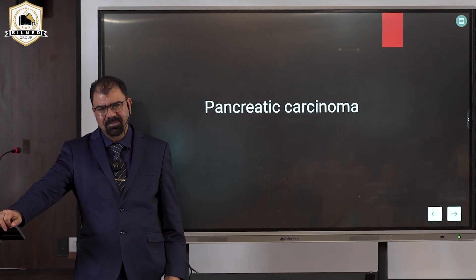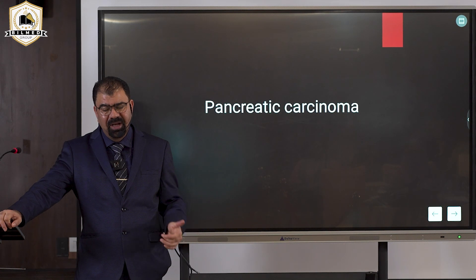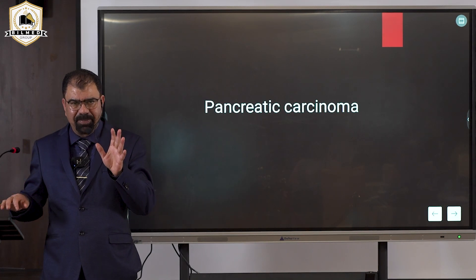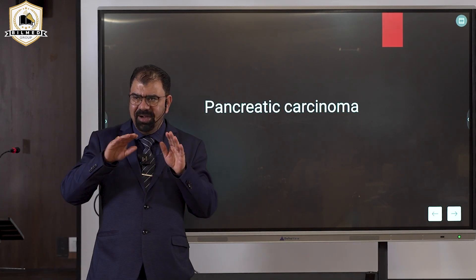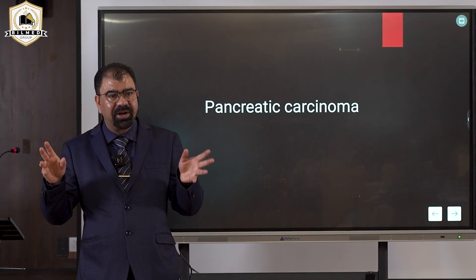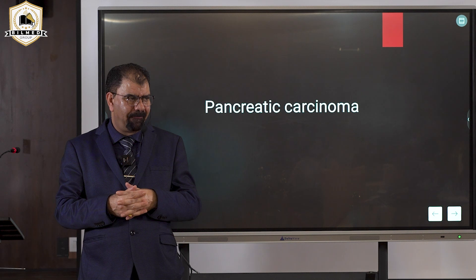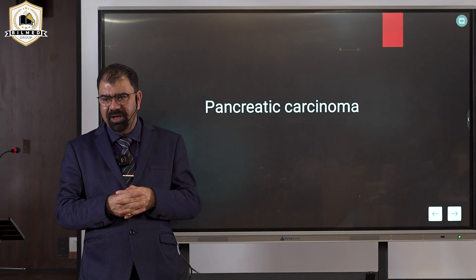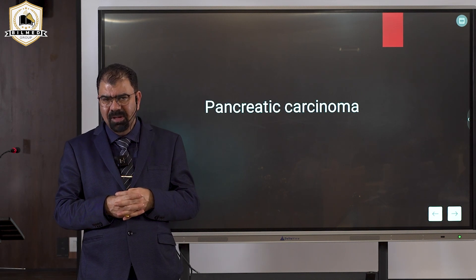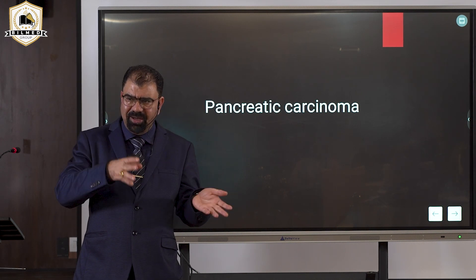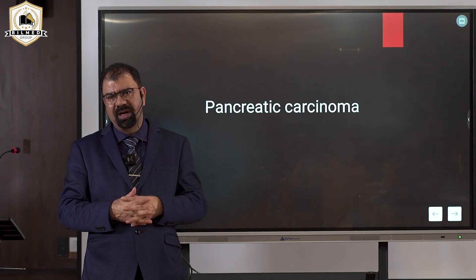This is the golden rule for differentiating malignancy from benign anywhere in the body. In pancreatic carcinoma, there will be a hypoechoic patch that is irregular, and on applying color Doppler it will show vascularity.